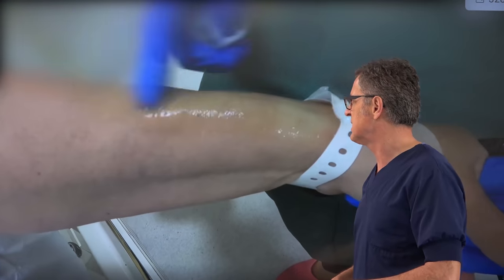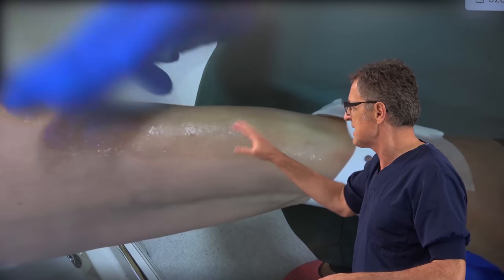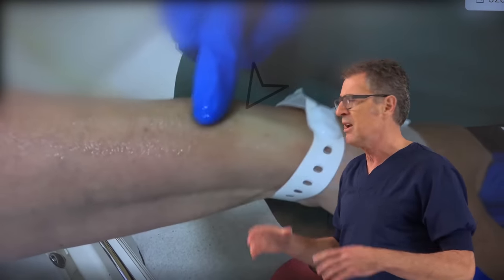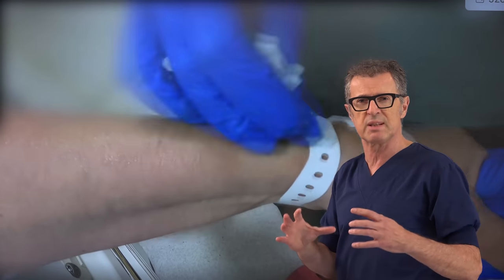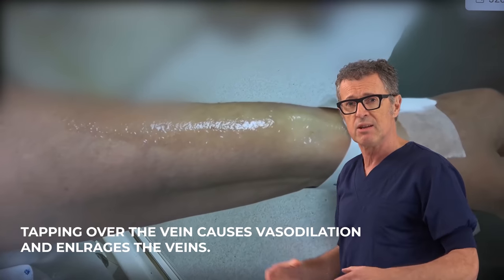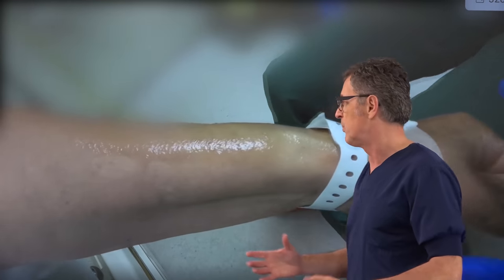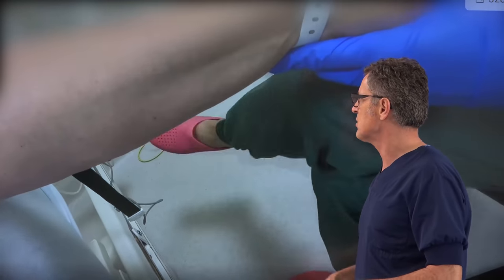We have now selected the distal cephalic vein. We cleaned the skin and applied slight tapping over the skin, which causes slight vasodilation that further enhances the veins. This is a really important maneuver that helps with vein recognition and engorgement.